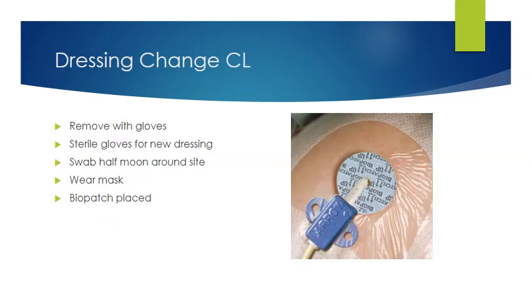Dressing changes for central lines, we would remove the old dressing just with regular gloves, and then we would apply sterile gloves to do the new dressing, because it is a sterile dressing change. And you guys all know about sterile wound care and how you would do a half moon around the site whenever you're cleaning that. You want to make sure that you wear a mask, and you also want to make sure that you place a biopatch.